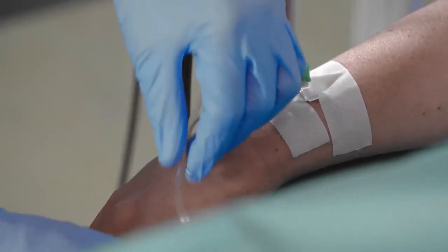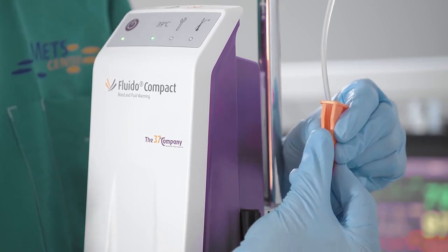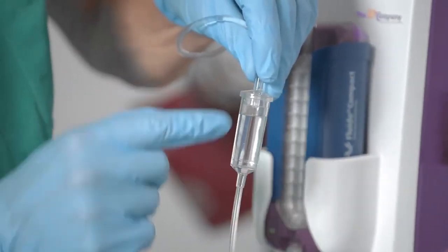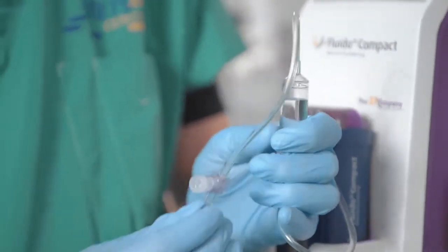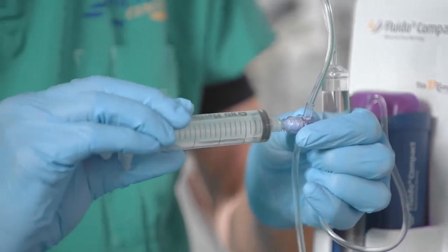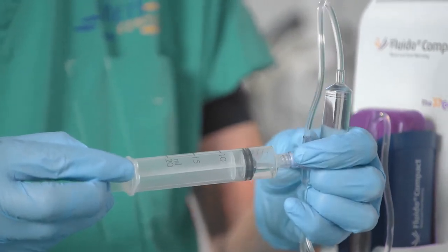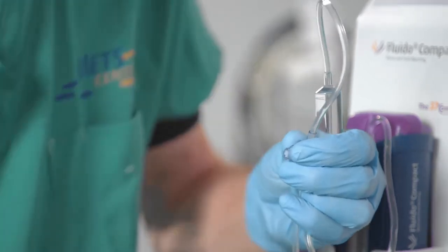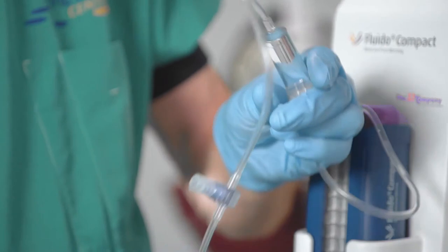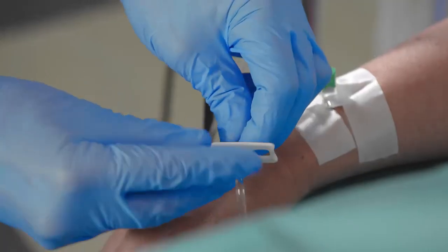To de-aerate the standard set with drip chamber, close the slide clamp of the disposable set. Make sure the roller clamp of the hospital administration set is open and the disposable set is in an upright position. Take the drip chamber from the holder and turn it upside down. Remove the protective cap from the T-connector. Connect a syringe to the T-connector and remove excess air from the system. Disconnect the syringe and reconnect the protective cap. Place the drip chamber upright in the drip chamber holder.